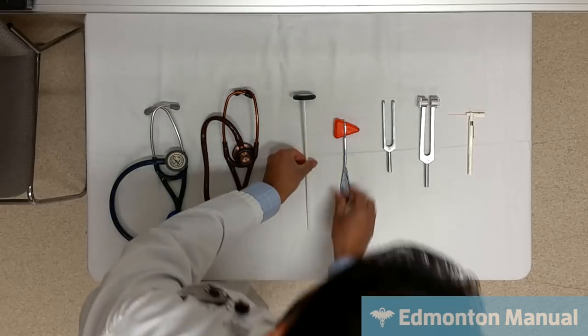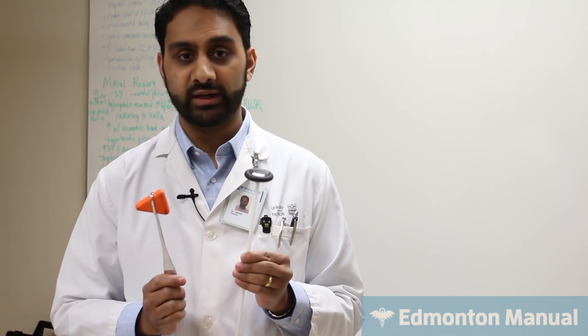So next we're going to be covering the reflex hammers. So these are probably two of the most common reflex hammers, although there are other ones you may see. And this one, the tomahawk, I'll be honest, gets a little bit of a bad rap. It's not as bad as you may hear. However, the key thing is you need to know how to swing it properly. This is, again, the Queen Square. It's a lot easier to use, especially if you're a novice, but we're going to demonstrate both of them.